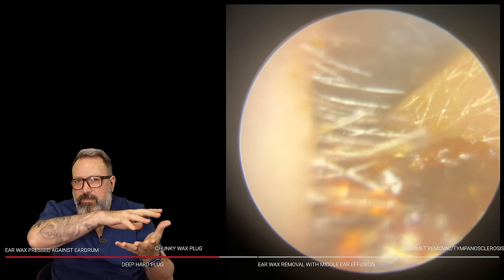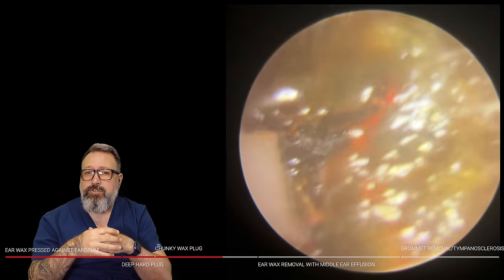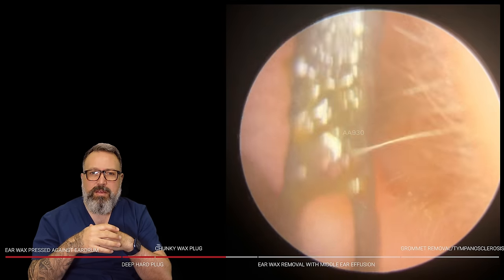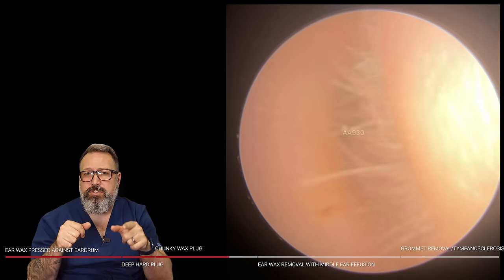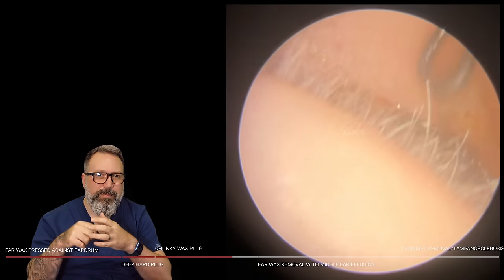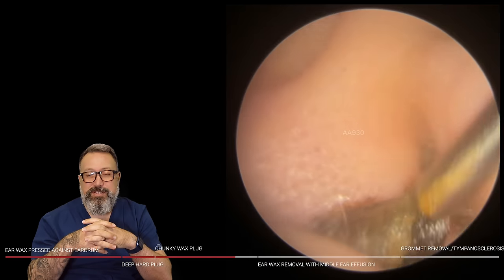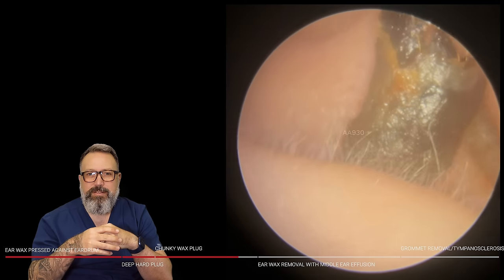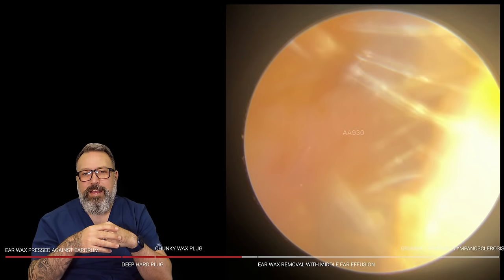You can see how that peeled and almost unfolded the wax — it's now moved to the outer portion of the ear canal. Getting behind it now with the Jobson Horne to bring this forward. There we go — out comes that plug. It was quite a chunky, solid piece. We pick it up with the suction just so you can see the size. It just doesn't want to pick up — you can see just how tough that wax is, slipping and sliding in the bowl of the ear canal.